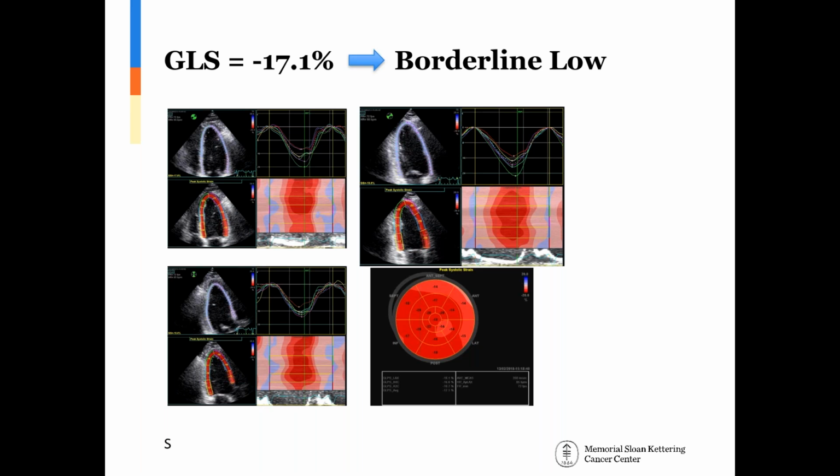And what's funny that you mention this, because I've noticed that the 2D image quality tends to be better in patients who are specifically designated to have GLS. So I think that at least in our laboratory, sonographers tend to pay more attention because they know how important the image quality is and how important it is to get on axis.